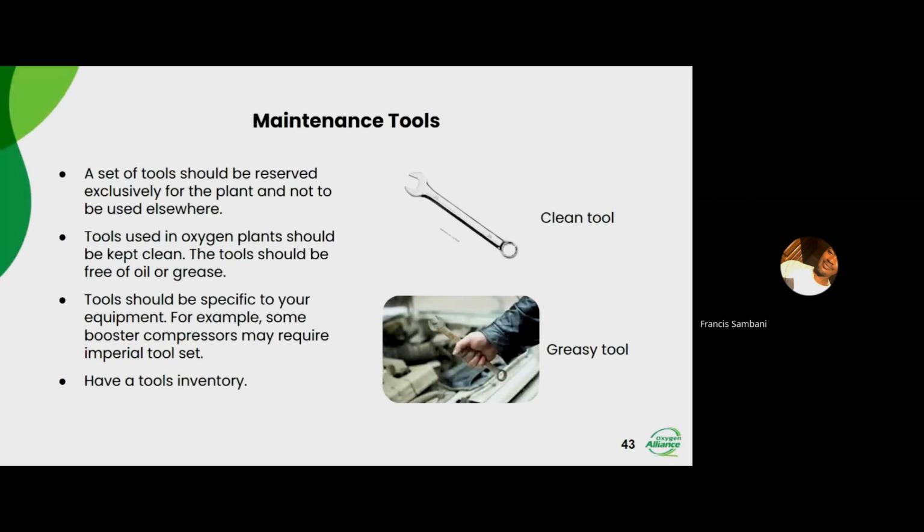We've had this problem before here at Tabelo, where the screw for replacing oil in the air compressor got to the point that we had to replace it because of using the wrong tool on that specific nut. So make sure that you use the right tools, and also have a tools inventory to make sure that your tools are well managed, so that in case of a service, you know that all tools are available. You have your torque wrench, you have everything else that you need for your service. So that if anything got out, you know where it is and how to get it back quickly. Next slide, please.